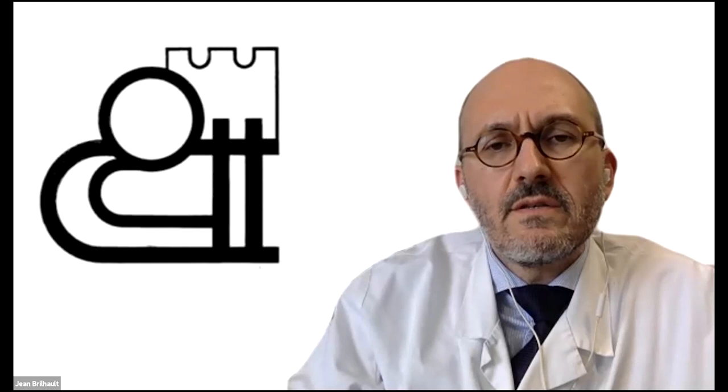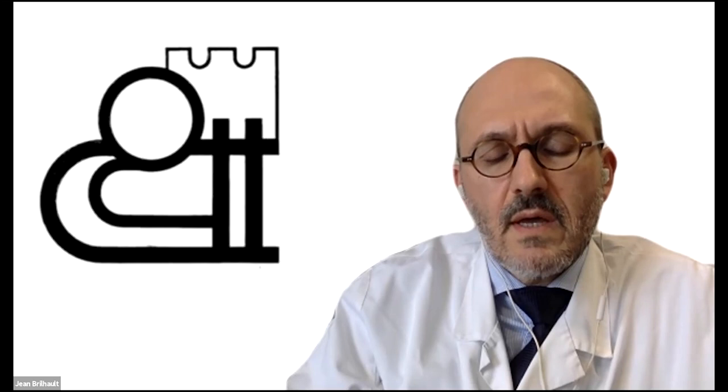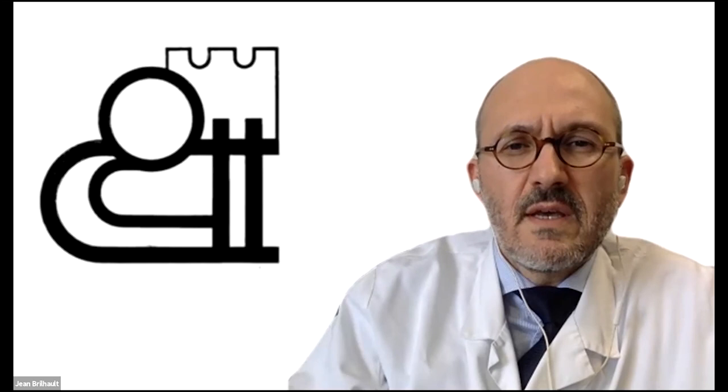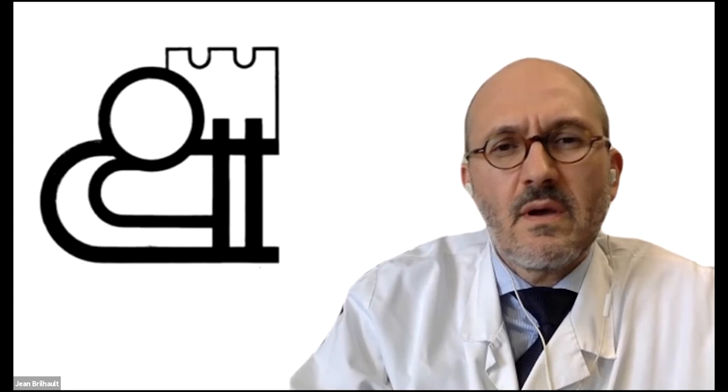I haven't really been successful with ankle fusion takedown when the ankle is fused, because it's too stiff. There is a bony growth all around after the ankle arthroplasty. You're very proud of yourself, or at least I was proud of myself, postoperatively, not so much, 3 or 6 months down the road.